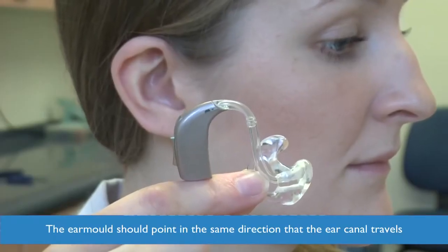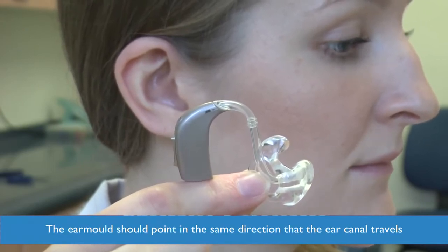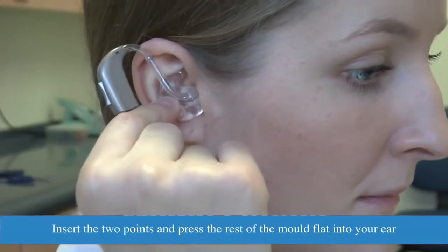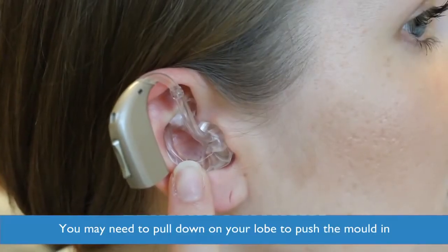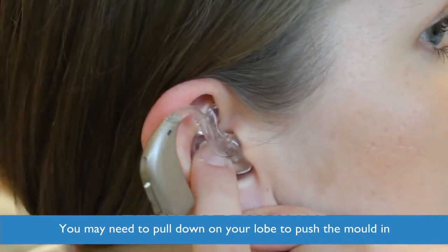Hold the ear mould so the part that goes into your ear is pointing in the direction that the ear canal travels. Insert the 2 points into the ear before pressing the rest of the mould flat into your ear. At this point you may need to pull down on your earlobe so you can push the mould in.